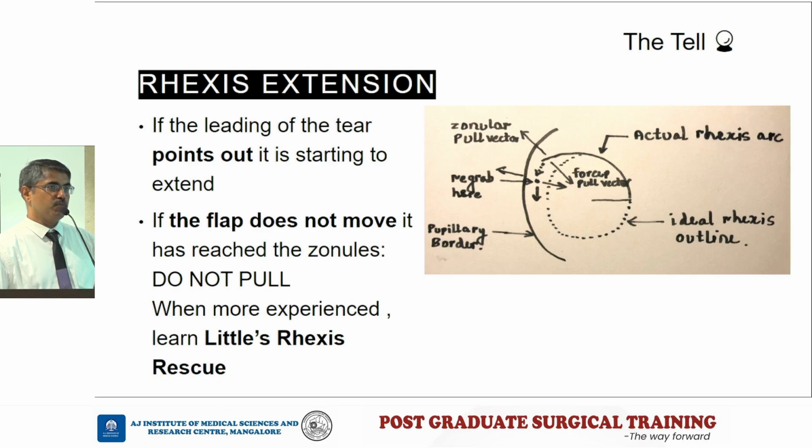Once the flap does not move, you should not pull the flap because you already reached the zonules. Any more pull is going to make the tear wrap around the nucleus. So stop if the flap is getting stuck.